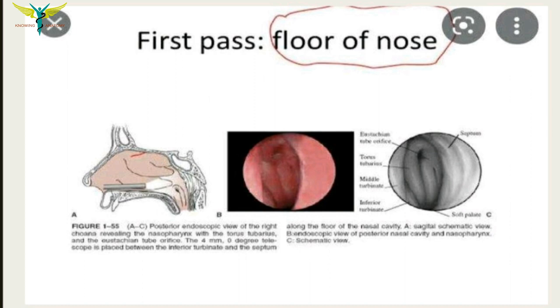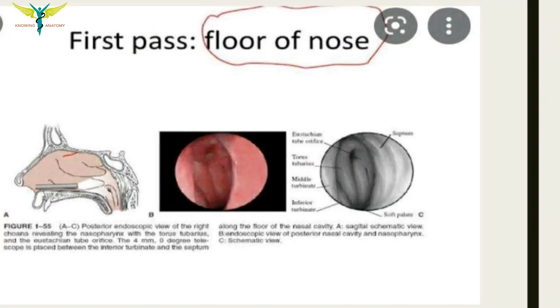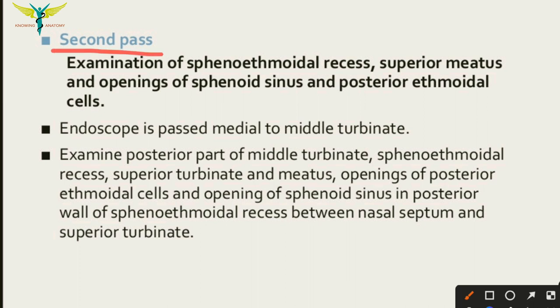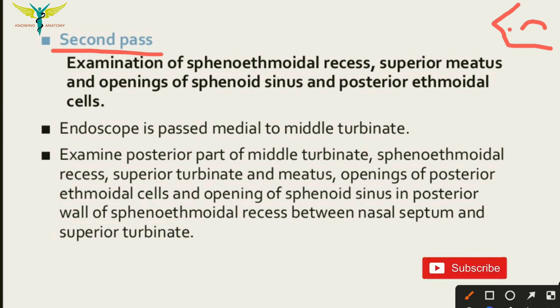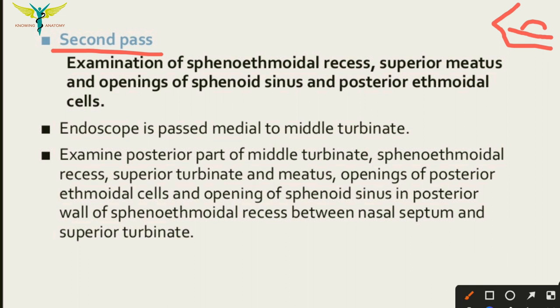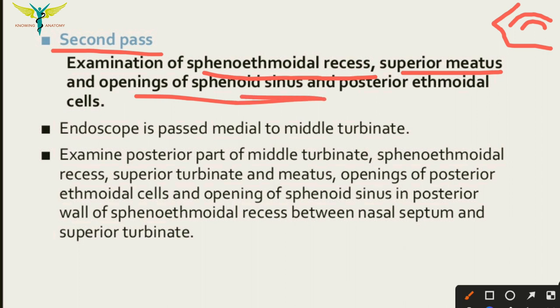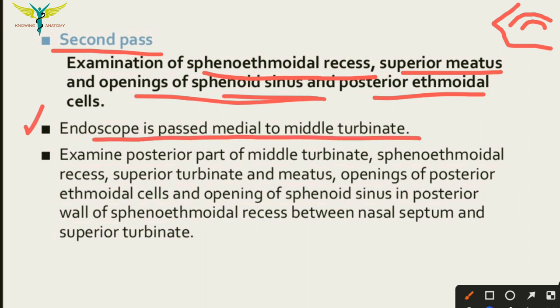In the second pass, the endoscope is passed medial to the middle turbinate. In the lateral view of the nose, this is the inferior turbinate; in the first pass we went along the floor, and in the second pass we go medially to the middle turbinate. In the second pass we can examine the sphenoethmoidal recesses, superior meatus, openings of the sphenoid sinus, and the posterior ethmoidal cells.